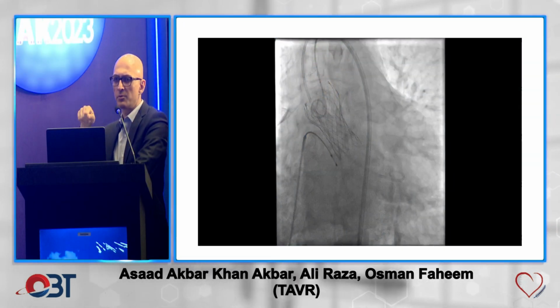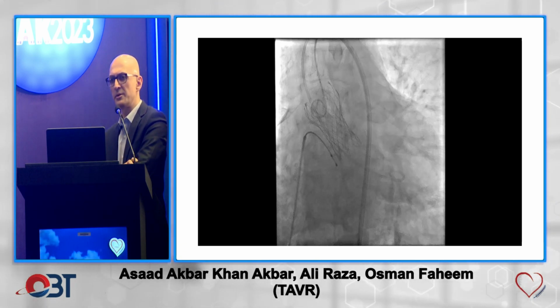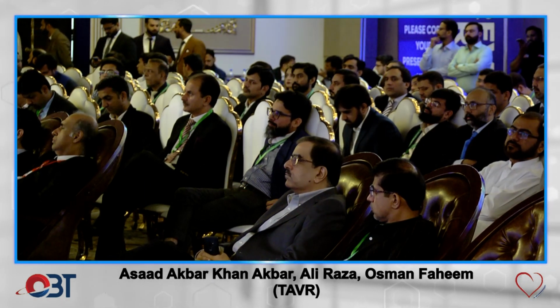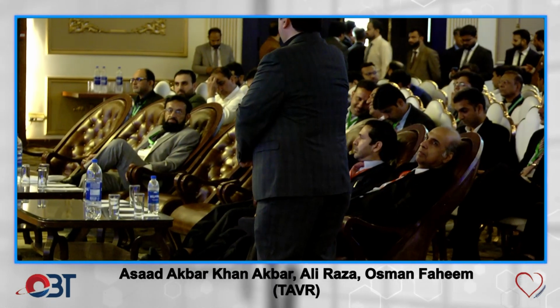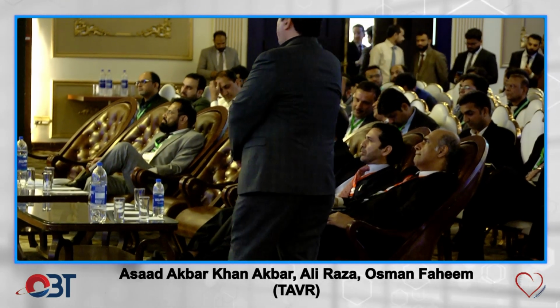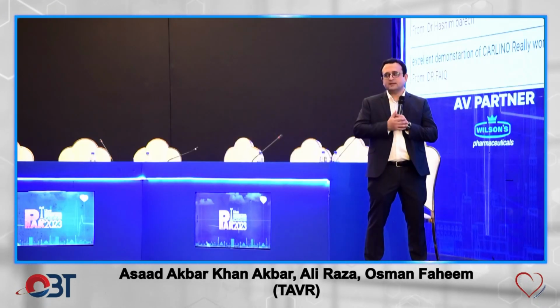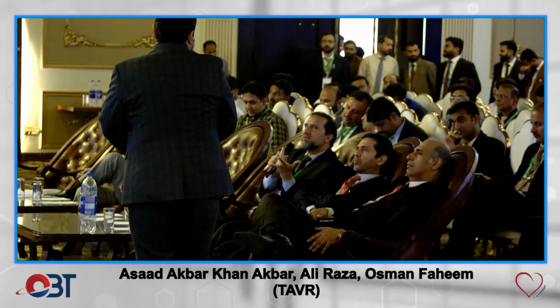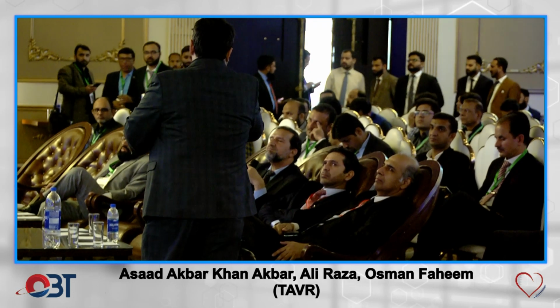I pace through the deployment, and there's a lot of forward force on the catheter. You do pace through the deployment. So that's your protection, right? Yeah. The pigtail is jailed, so you are not worried that while pulling it, it may... Pigtail is basically jailed while deployed. It usually comes out. There's no issue with the pigtail. A lot of us take it out before. Some people leave it in. Yeah. Is it needed to jail it, or it's not needed? Yes. Then you take it out.